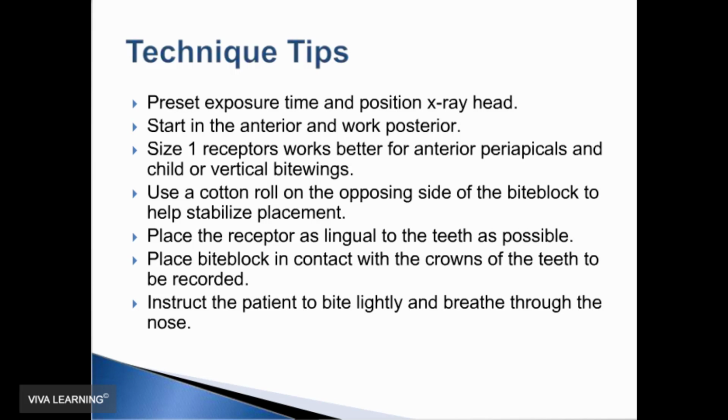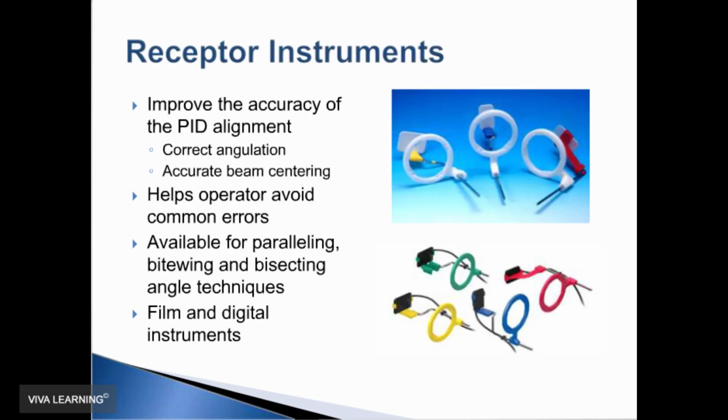It's also very helpful to give the instruction to have the patient breathe through their nose. When the patient breathes through their nose, it's not possible for them to gag. Gagging is momentary cessation of breathing, and this will help ensure that they don't gag during placement.